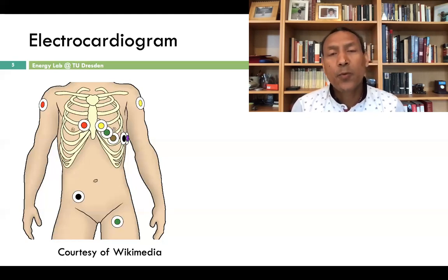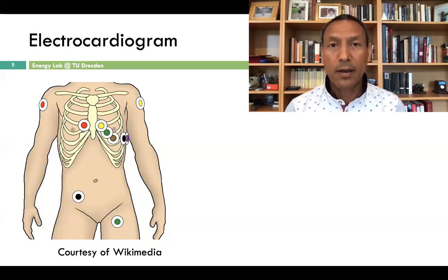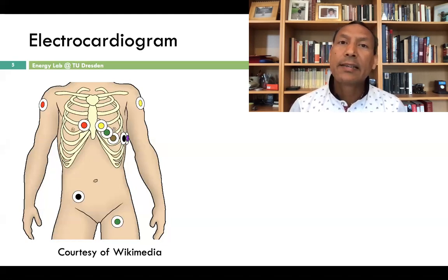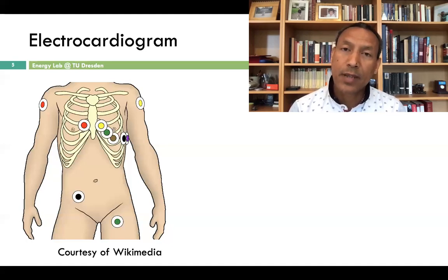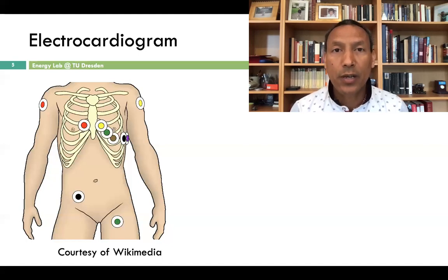But the problem of using wireless electrocardiogram is that when the people are free to move, then the electrodes placed on the surface of the skin vibrate.